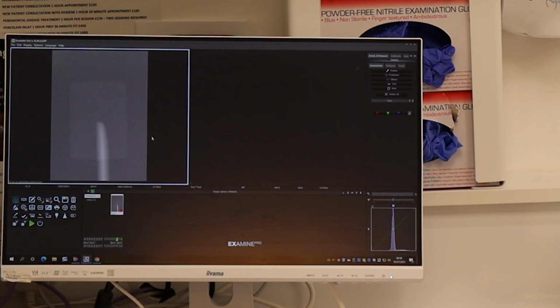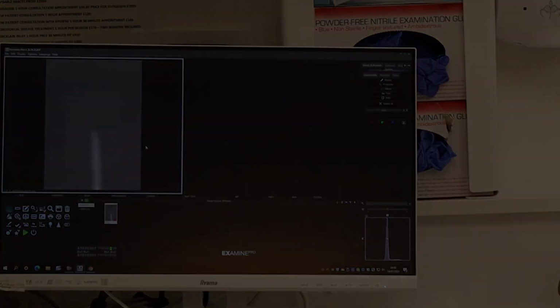You then have a quality measure, which is either 1 means perfect, 2 means clinically diagnostic and a retake not necessary, 3 means that a retake was necessary. So you record this, you can ask the dentist for feedback on which one it is, and then you label it either as a bite wing, a periapical or a panoramic. This is important because this is how we use the software to do a continuous audit to measure the quality and the number of X-rays we're taking.